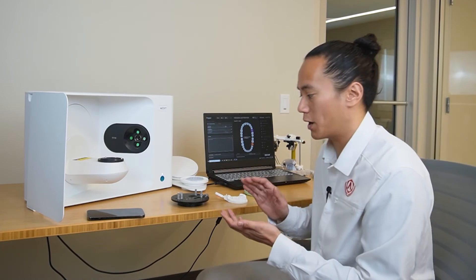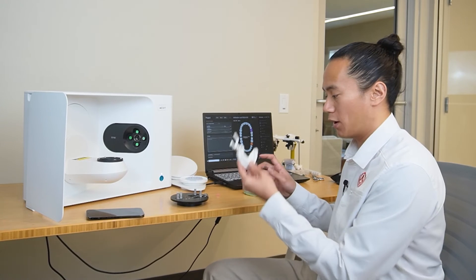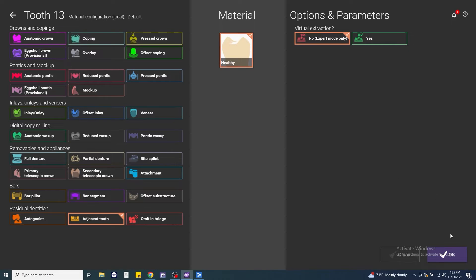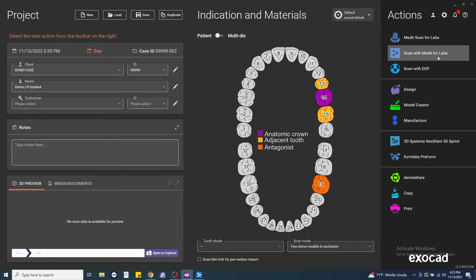The software will automatically mark an antagonist set up for us. We do have our opposing scan, so we're going to leave that as is. And then we'll make sure to mark our adjacent teeth as well. From there, we'll click save. And then scan with Medit for labs.